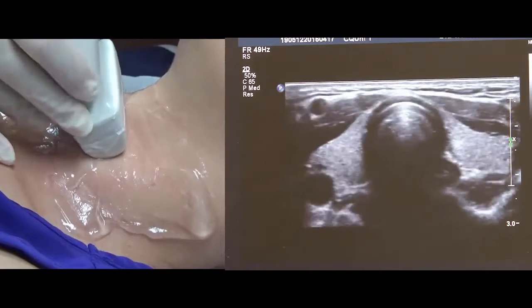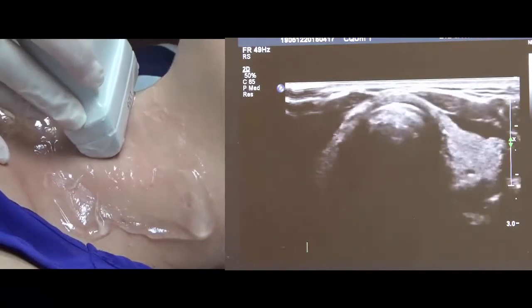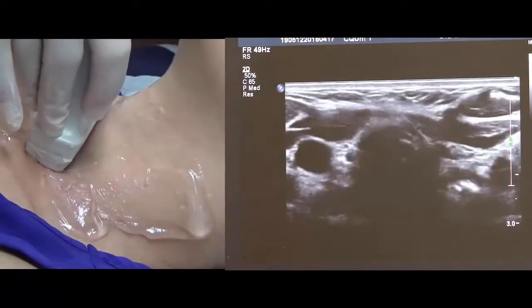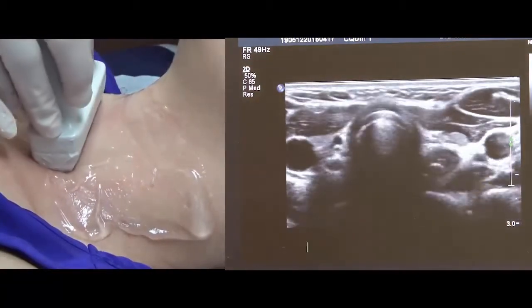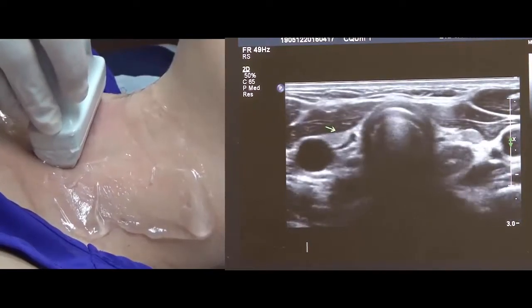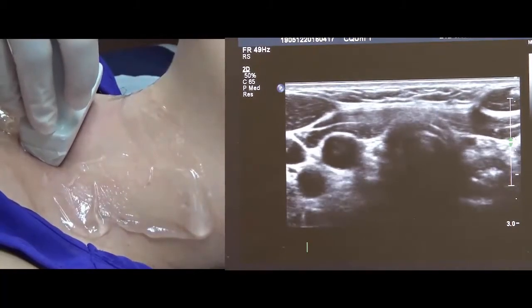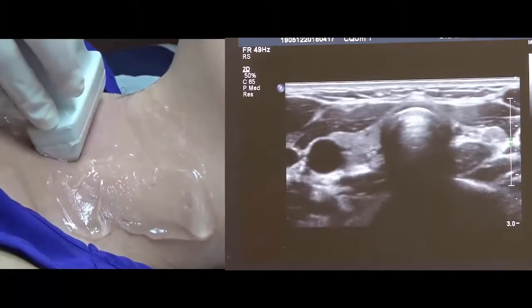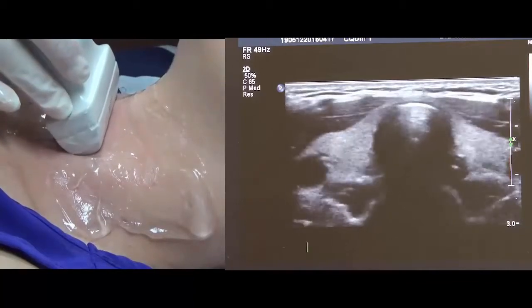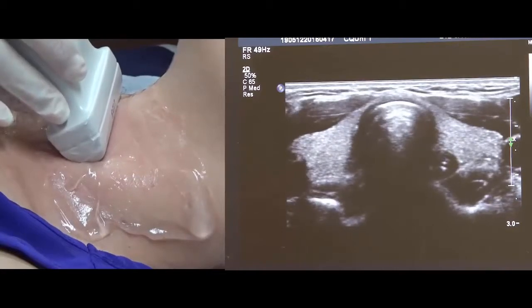So from here, we're going to survey the entire gland. Now to start with, we're going up to the head, to the submental region, coming back to midline, looking at the contours, trying to keep them centered, all the way down to the feet, making sure that this is the lower section, the lower pole. You're going all the way out till it totally disappears, so that I know, and 2 centimeters underneath to make sure there's no lesions or any adenomas that might be sitting there, and then back to midline. So this is just a general lie of the land, general overview of what we're likely to expect and how we can plan the scan.